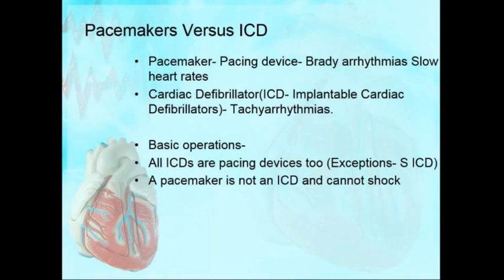But if you go slow, the pacemaker kicks in. So that's something you may have to communicate to the patient too. The reason we are putting a pacemaker for your tachybrady syndrome is, if you are slow, the pacemaker kicks in. But if you are fast, we can give you medicines without the fear of dropping your heart rate. But the pacemaker is not going to work on your tachyarrhythmia. Okay? Misconception one, actually commonly carried among internists and family practice doctors. Pacemaker is a Brady indication. Now, defibrillators.